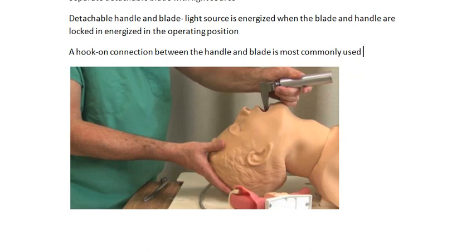So that's why the hook-on device is used. So this is how it is done. A non-dominant hand is used. Here we can see the laryngoscopic blade. It's of various sizes depending on the size of the patient. When we ask the patient in pre-anesthetic evaluation to open the mouth, based on the position of the soft palate with respect to the tongue, we can decide the size of the blade. That is a different topic as such. So this is the laryngoscopic blade.